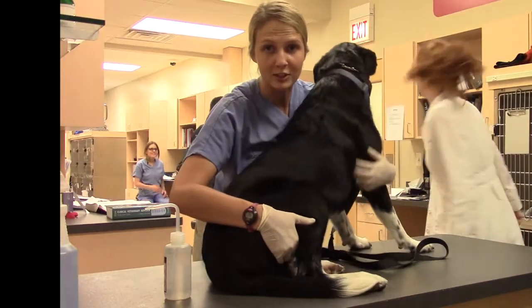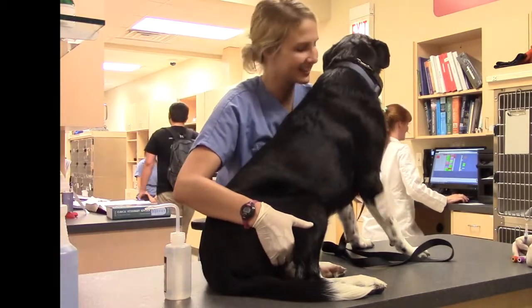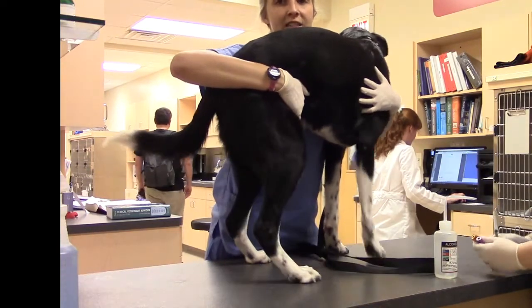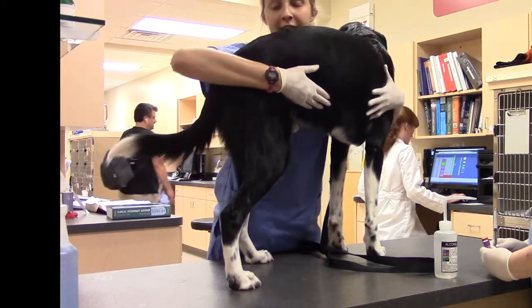This is Sarah Levine. We're actually going to be doing a cephalic blood draw on this dog. I'm going to hold in a position that's going to allow Caroline to palpate the vein. I'm going to occlude it with my hand, but I'm also going to hold him in a way that I can control him, because as of right now you can see I can't really do that.